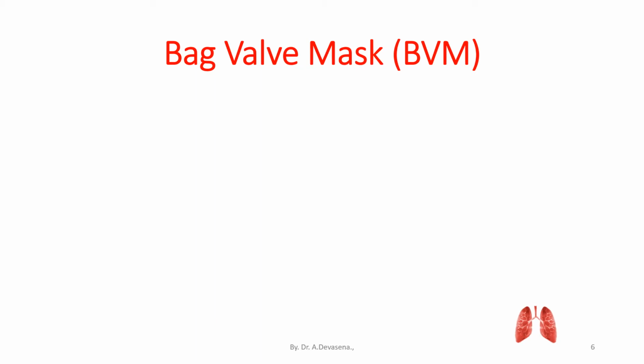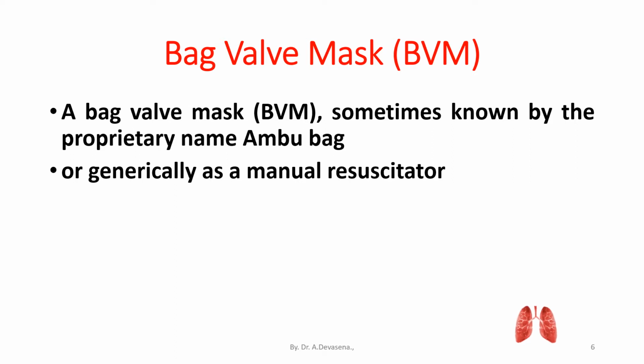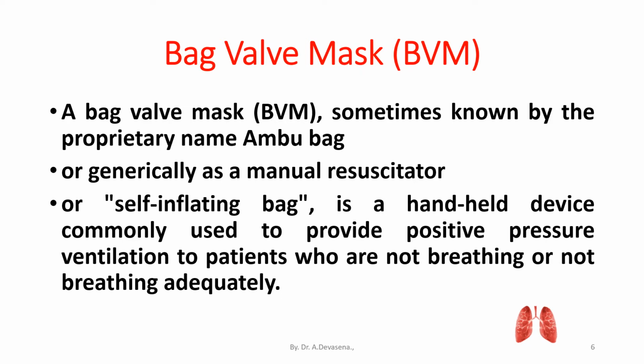Bag valve mask, BVM. A bag valve mask, sometimes known by the proprietary name Ambu bag or generically as a manual resuscitator or self-inflating bag, is a handheld device commonly used to provide positive pressure ventilation to patients who are not breathing or not breathing adequately.